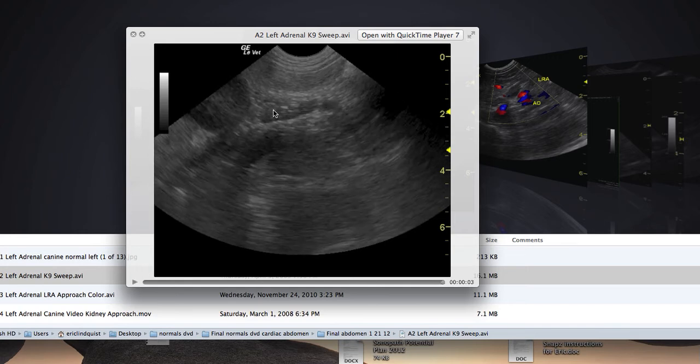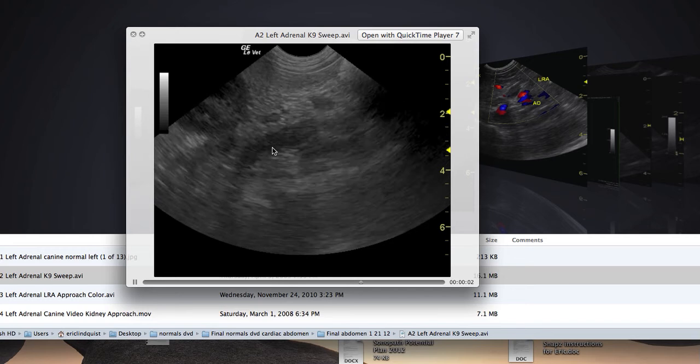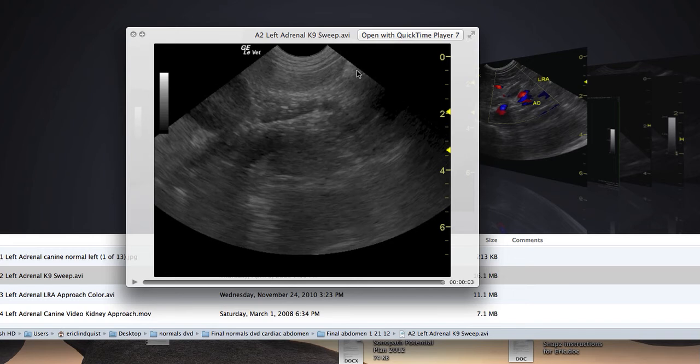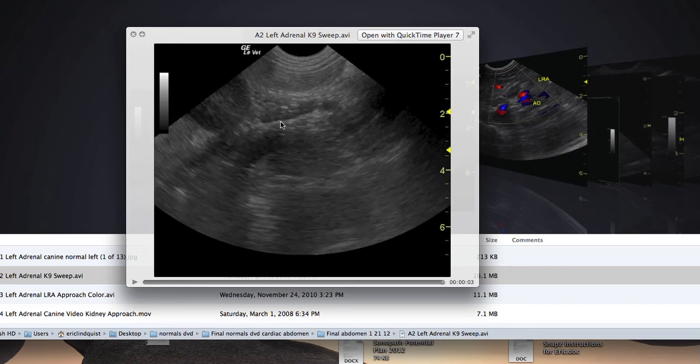Once I find it, I gently twist the probe, spreading out the pressure so the patient isn't going to get upset. Spreading out the pressure moves the descending colon out of the way and keeps it out of the way, so it's not going to interfere with my image. The colon was in the way, but I need to get into that left adrenal gland by means of the aorta and the left renal artery. The kidney is pushed all the way over here.